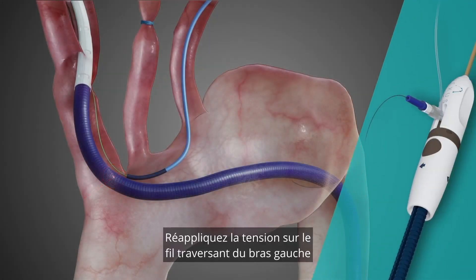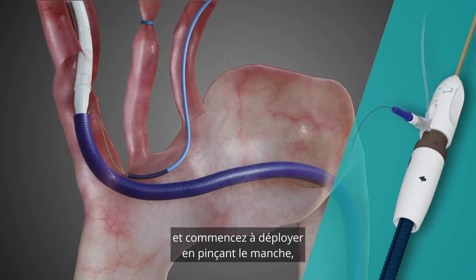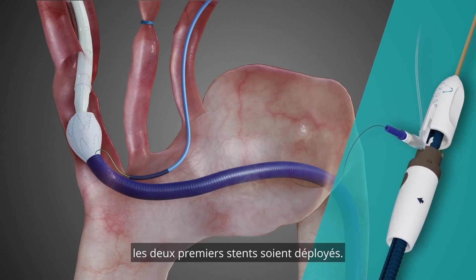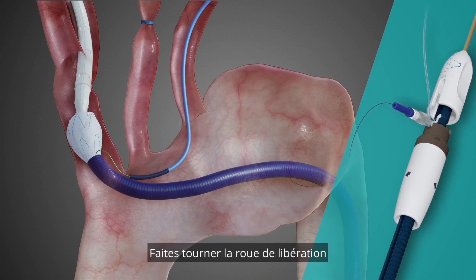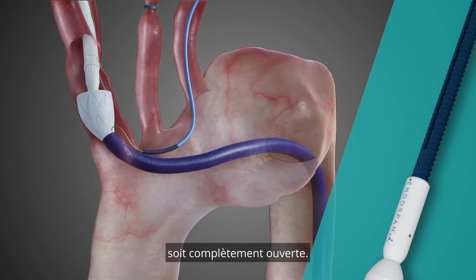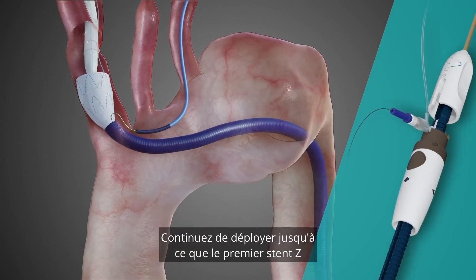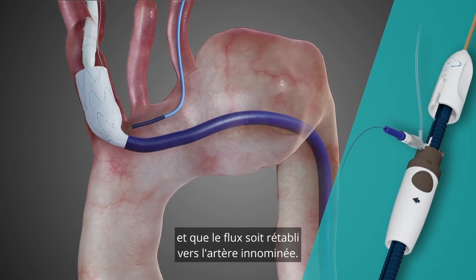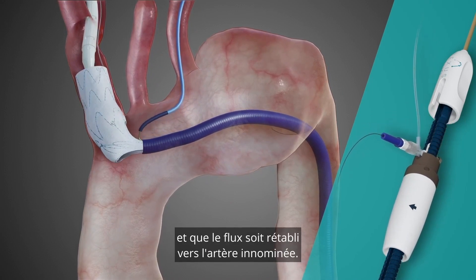Reapply traction on the left arm through and through wire and start to deploy by pinning the handle and rotating it until the first two stents are deployed. Spin the release tip capture wheel until the distal end of the stent is fully opened. Continue to deploy until the first z-stent of the dock sleeve is opened and flow is re-established to the innominate artery.